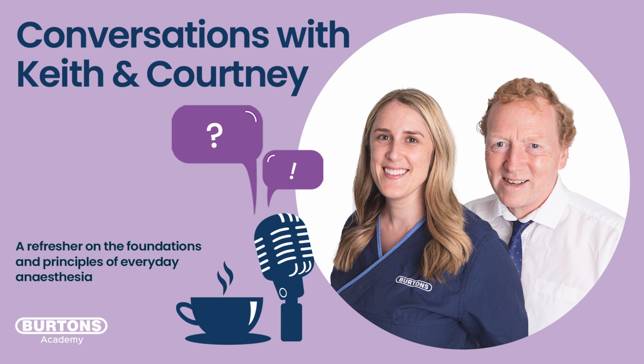And I like to use the pulse ox in recovery because that's truly where a lot of our patients are hypoventilating because of the anesthetic drugs that are left over, because they're really cold. Perhaps there's a bit of thoracic pain. So when they take it, they don't want to take those deep breaths in because it hurts them quite a lot. So I quite like using it in the recovery period.